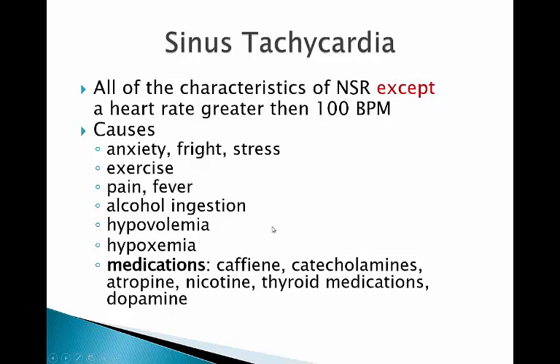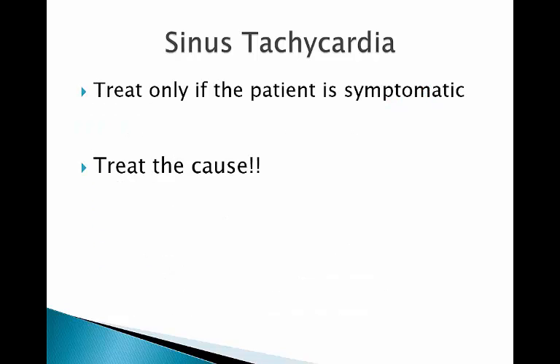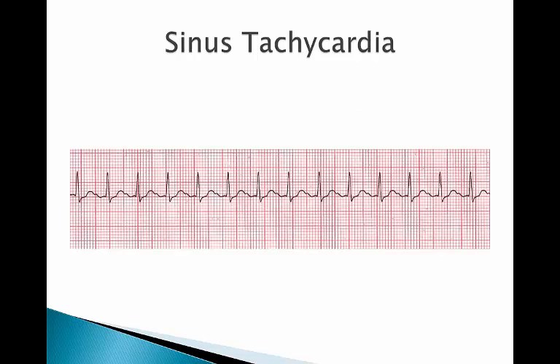Now, how do we treat sinus tachycardia? We treat them if the patient is symptomatic, and we treat the cause. Treat the cause of tachycardia, of sinus tachycardia, that is. So, treat the cause of sinus tachycardia. Got that? Here's a nice little strip of sinus tachycardia.